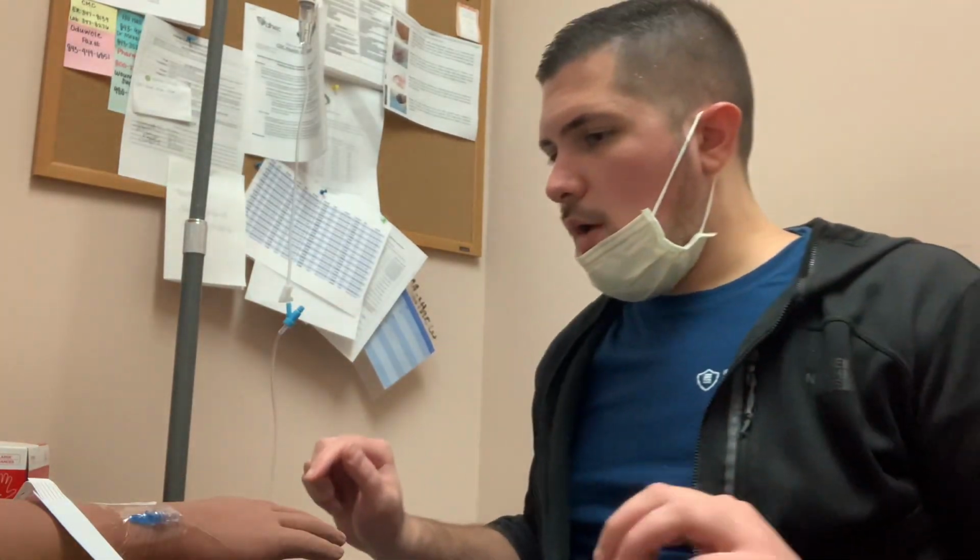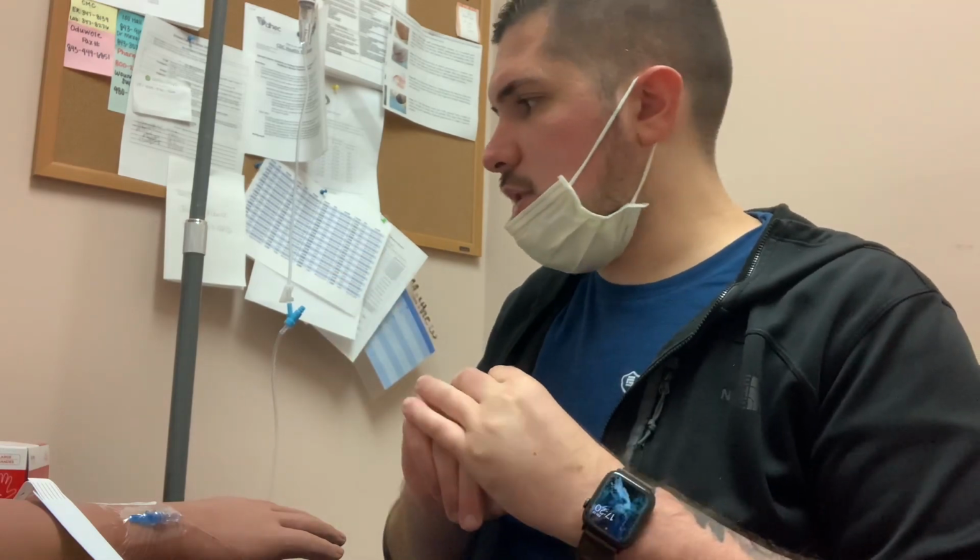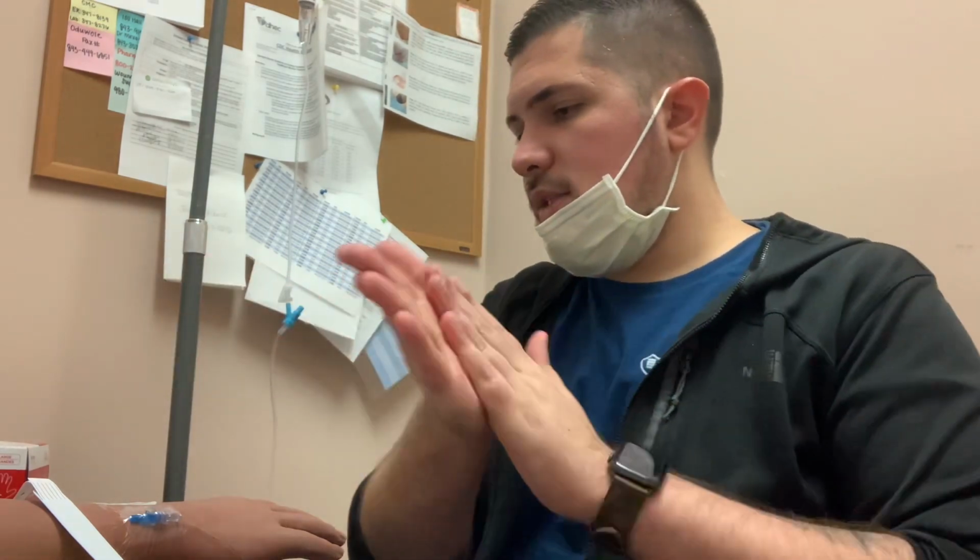Alright, and we will monitor for any adverse reactions, and we assess the site, and there's no signs and symptoms of infiltration. The patient is comfortable, and no signs and symptoms of distress. We'll provide hand sanitizer one more time, and we will continue to monitor the patient.